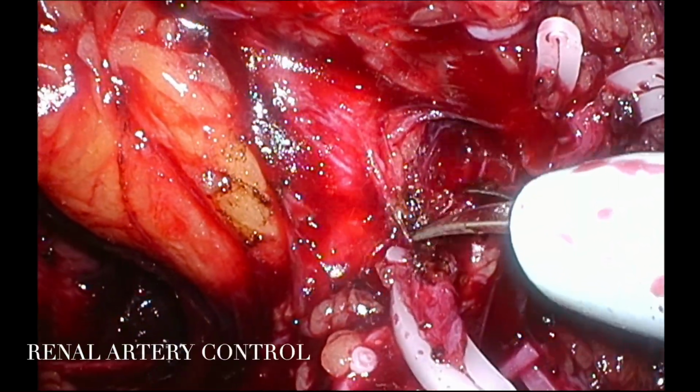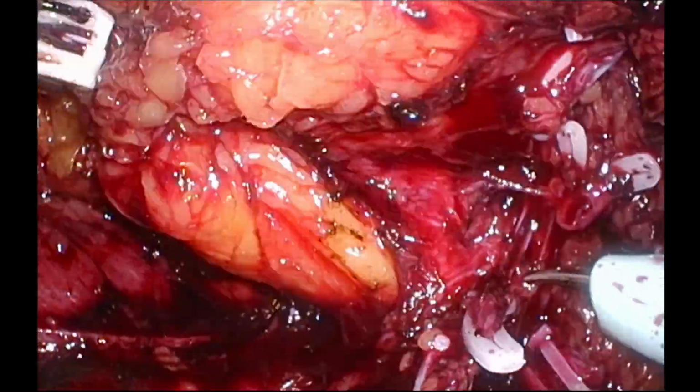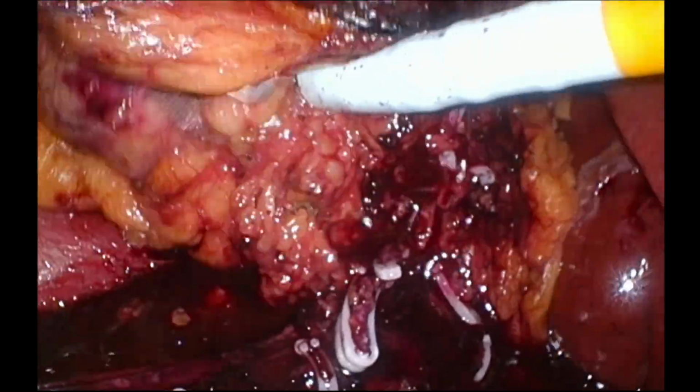After cutting the renal vein, the main renal artery, which was clipped previously and was behind the renal vein, can be seen.